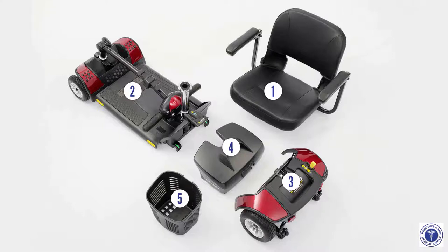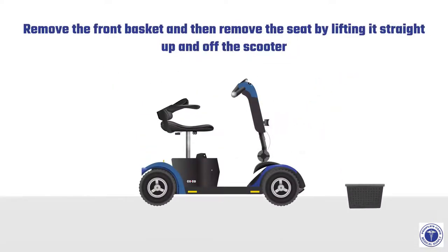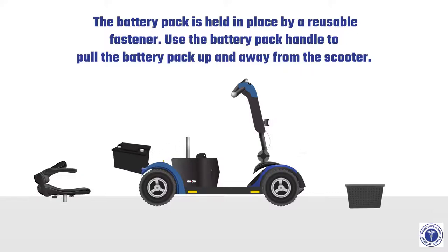Before disassembling the scooter, remove the key and place the manual freewheel lever in the backward drive position. Remove the front basket, then remove the seat by lifting it straight up and off the scooter. Remove the battery pack — it is held in place by a reusable fastener. Use the battery pack handle to pull the battery pack up and away from the scooter.